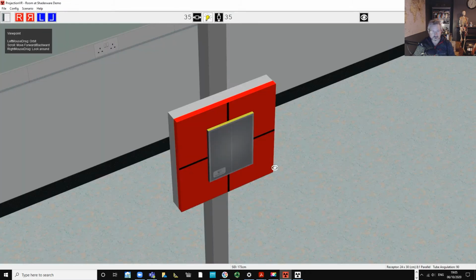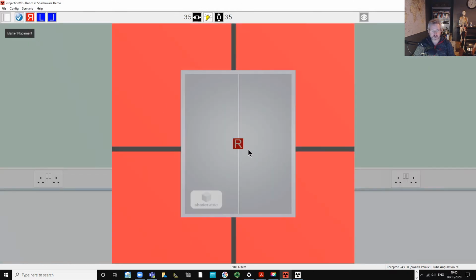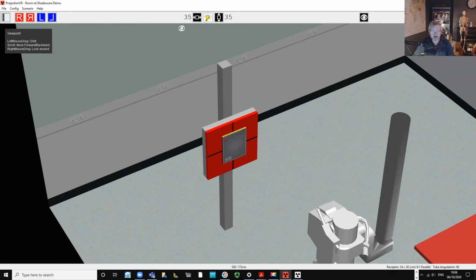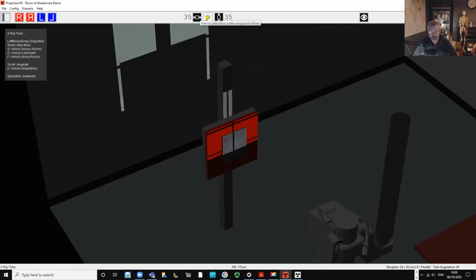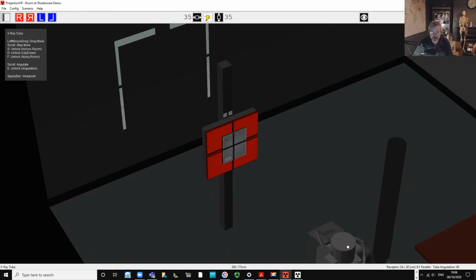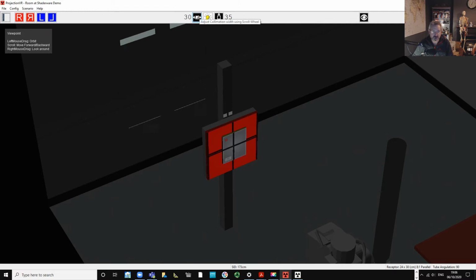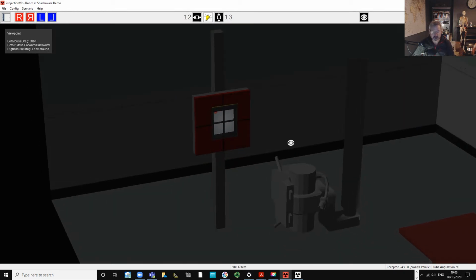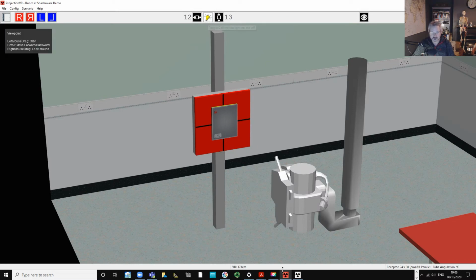So it's a right shoulder, so we'll go back and put a right marker on here. If you imagine the patient is going to be facing you, the lateral aspect of their shoulder is going to be over that way, so we'll put the marker there. Now we're all ready to go. I don't want to blind the patient with the light, so I'm going to drop that down and collimate to the size of the receptor. Obviously I'm going to be bringing this in, so I'll have to change that again, but at least I'm not going to blind the patient if I turn the light on in that way. Okay, so I think I'm ready now.